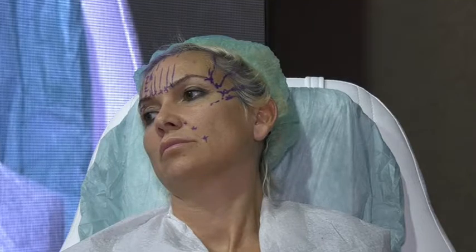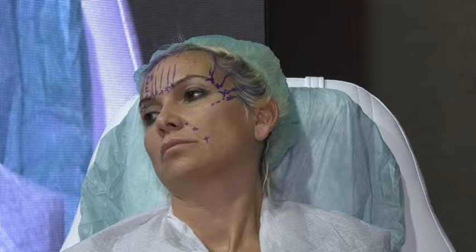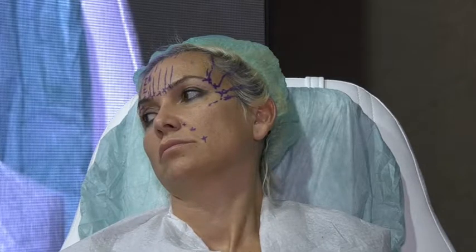For example, I should collect all the threads to this point. So what I will do is create another one here and another one here. So it's going to be three points near each other, and then I collect the first one to this, the second one to this, the third one to this. So each one goes to one point. Not parallel, no. Look here, because you are starting from this distance, it's all going back. Okay.